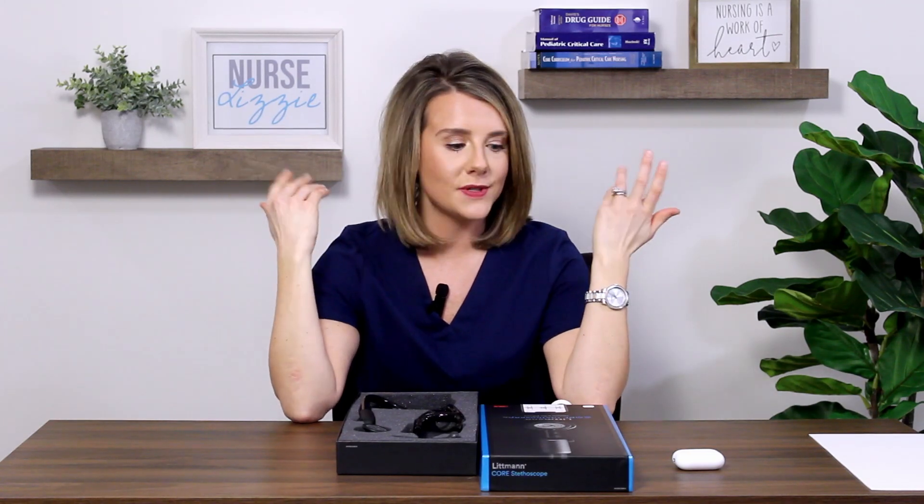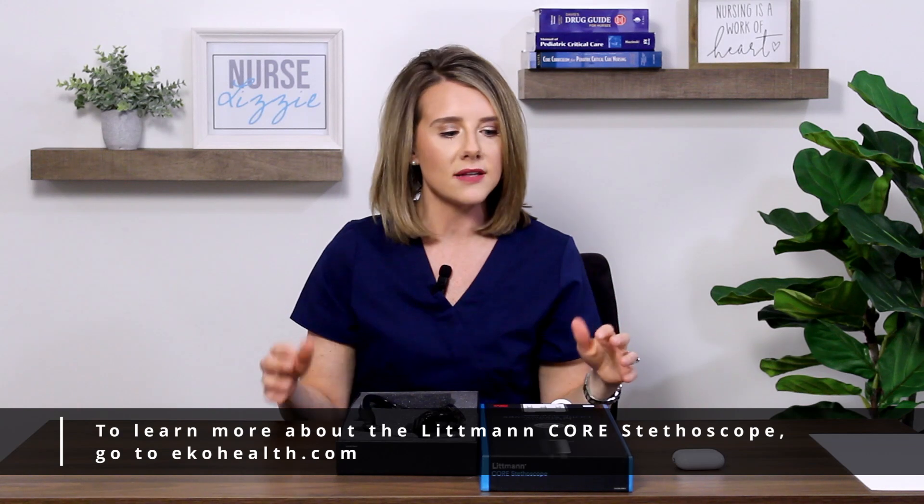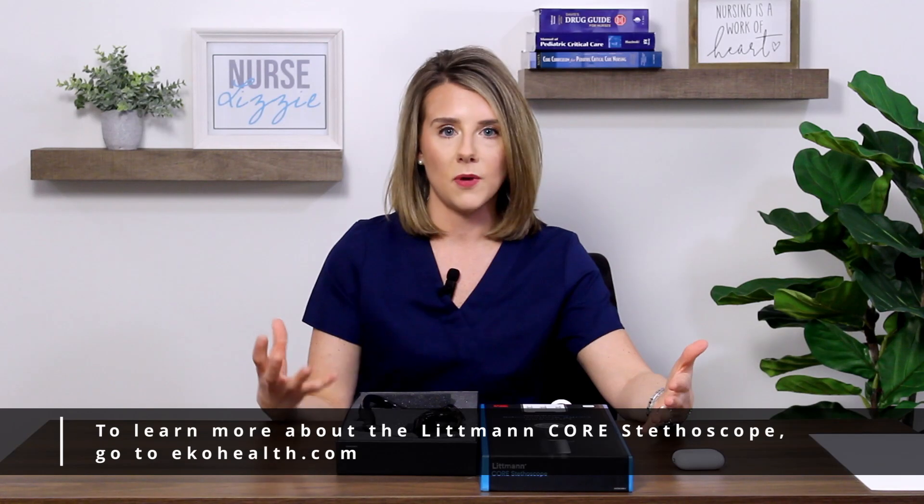As you'll see on the website, one of the features I love about this is it does have 40 times sound amplification. That's really awesome, especially if you're working in a loud environment or a fast-paced setting — I think of friends working in an ER or as an EMT with a lot of background noise. It also has Bluetooth capabilities, meaning you can use any wireless Bluetooth device and listen through the Echo app. If I'm in a lecture setting, I can share audio with my students to help them learn about different heart sounds, lung sounds, and bowel sounds.